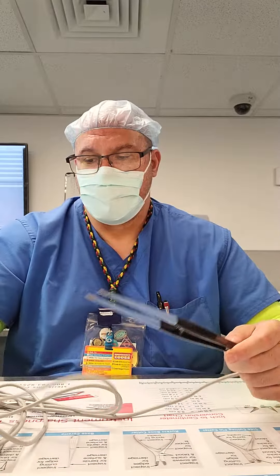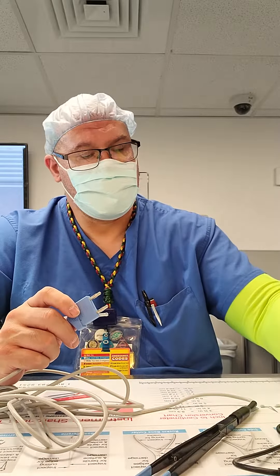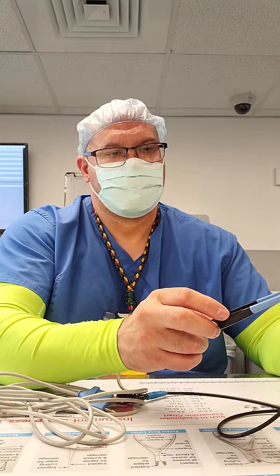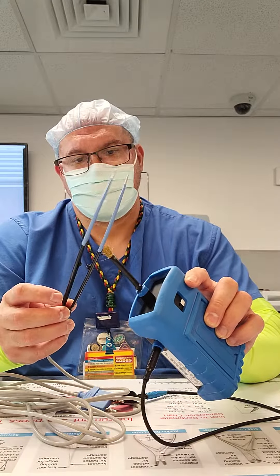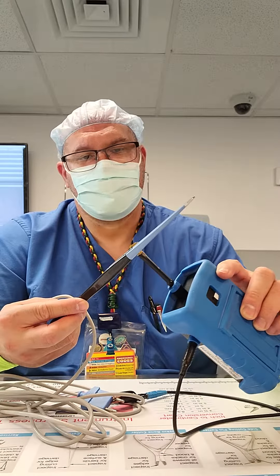Welcome back. So I got a new cord and we're going to go ahead and insulate test this thing. The tips are good. Going on the shaft. Going to the connectors.